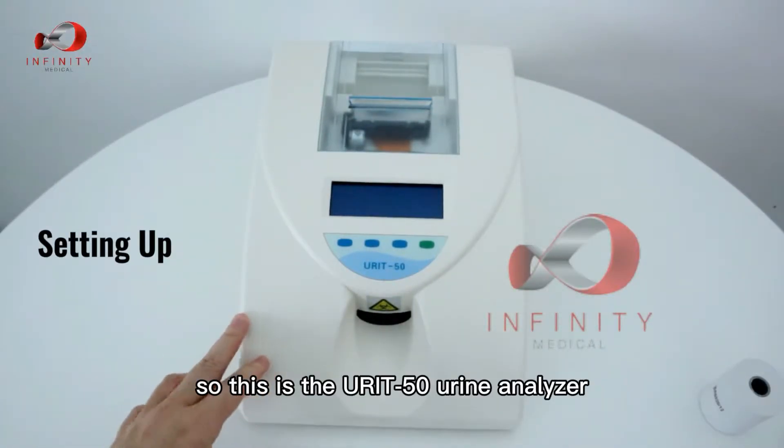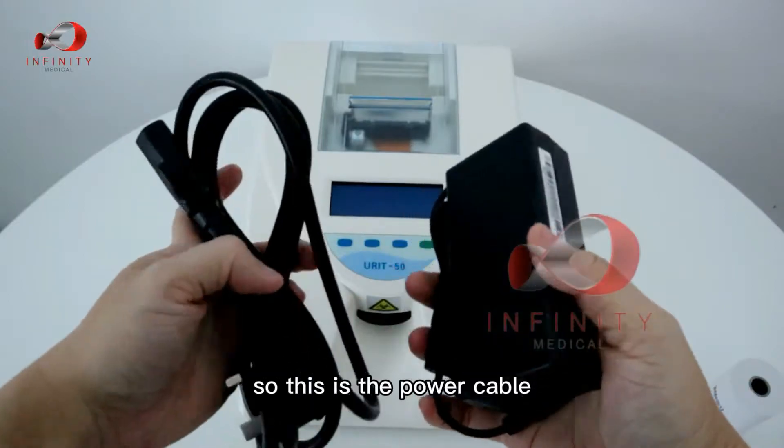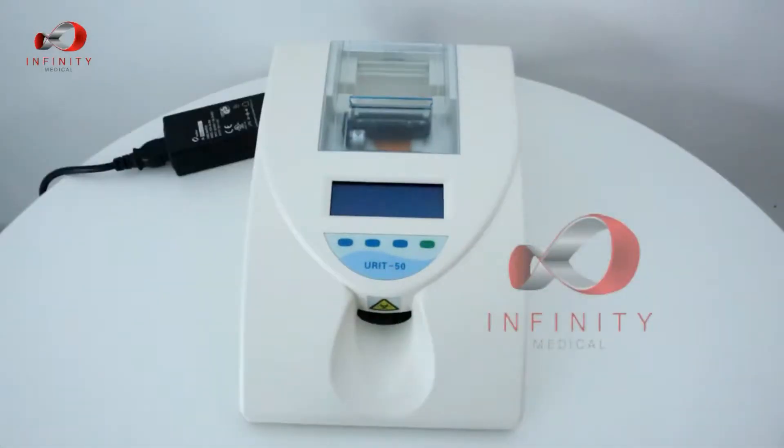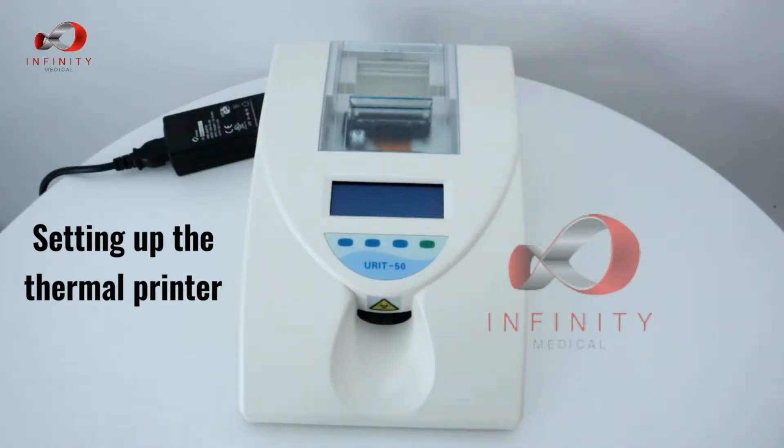This is the URIT-50 urine analyzer. To set up, first connect it to the power adapter — this is the power cable. Before turning on the device, ensure that there is thermal paper loaded for the thermal printer.